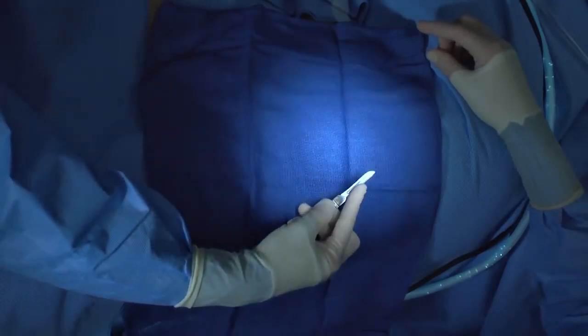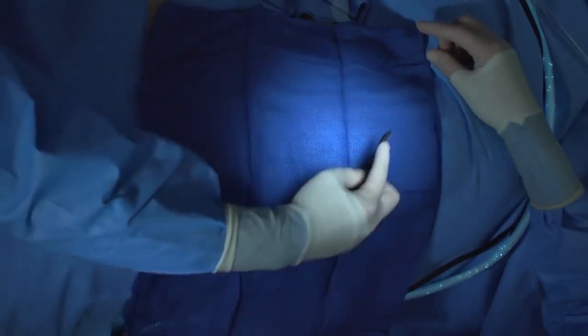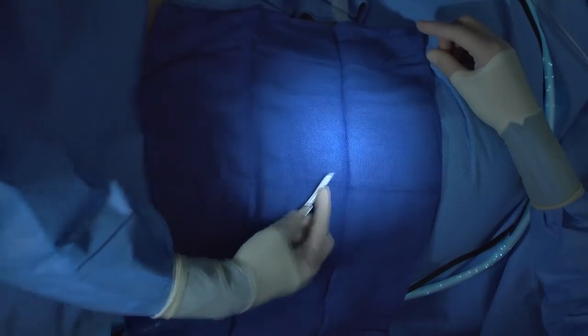Knife technique. Please note the proper way to hold the scalpel. This allows for a controlled incision.